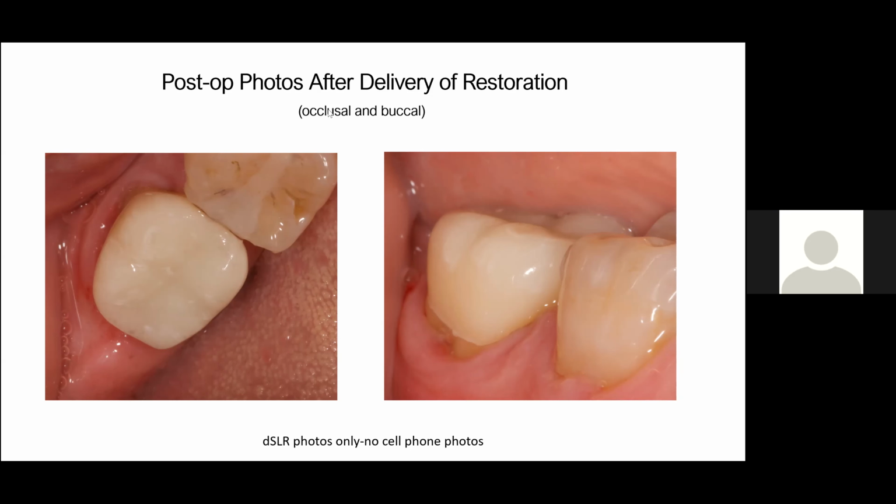Doctor, I just have a general question. Do you have to update the hardware and software pretty often with these 3D scanners, or are people keeping the same scanners from way back when? It's like a Tesla. Some of the things are software updates that you can just download, and it's more like modules, whatever modules you purchase.